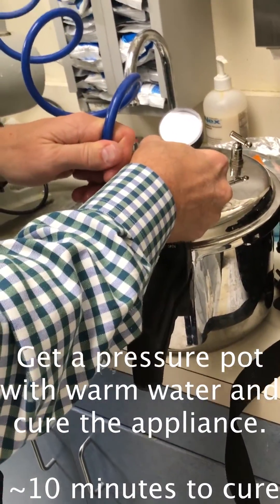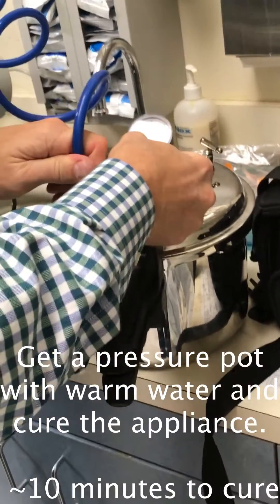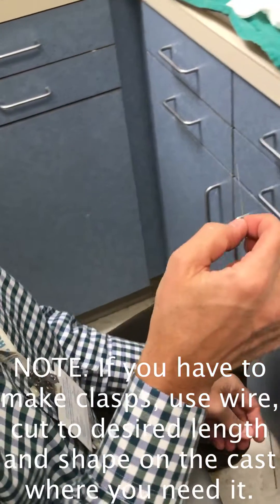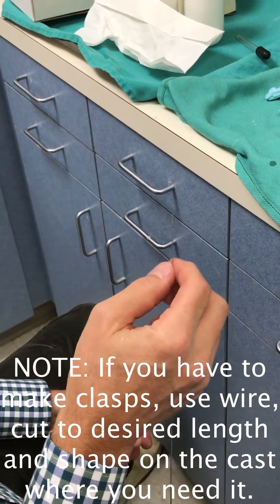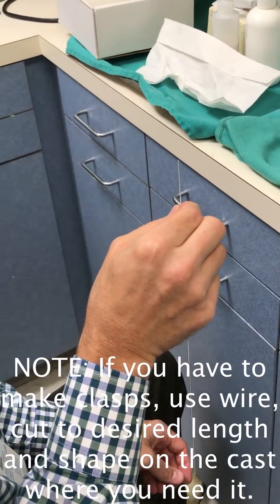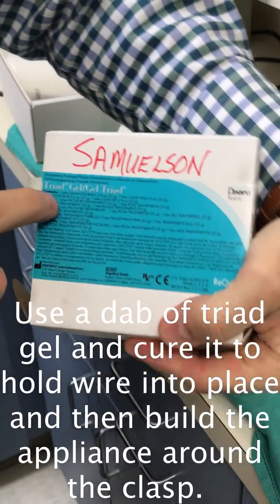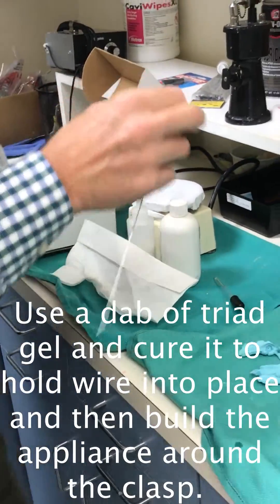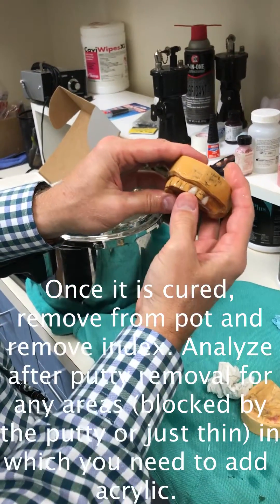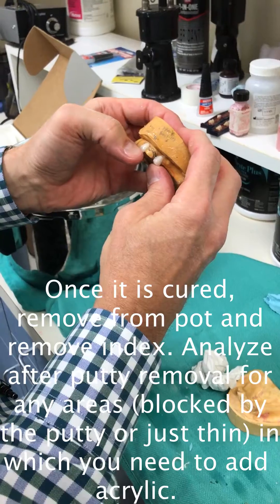This has a self-limiting valve on it, so it's going to go up to about 30 and then kick off — it's a safety valve. So the clasp wire goes on. You want to cut a length of wire that has some undercut within the major connector, then contour your wire to sit on the tooth. You put a little dab of triad gel there, cure it and hold the wire there, and then build the partial around it.